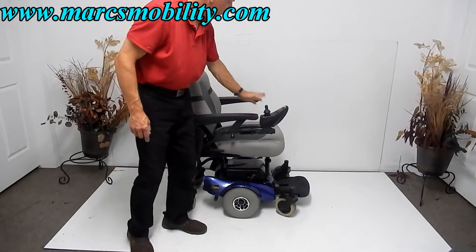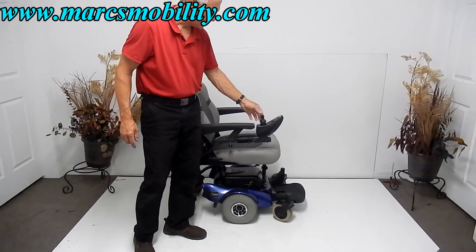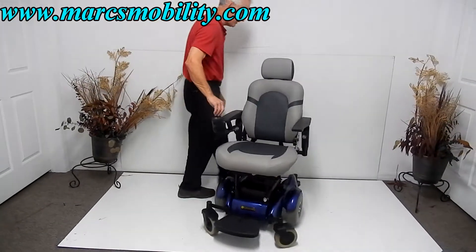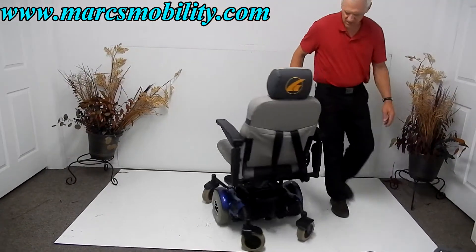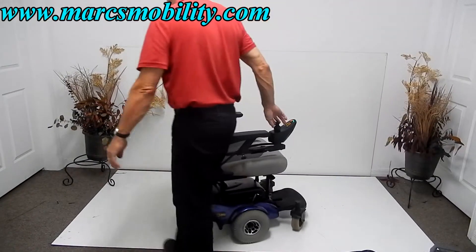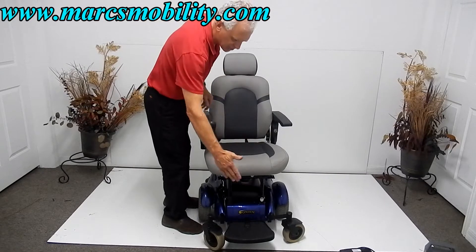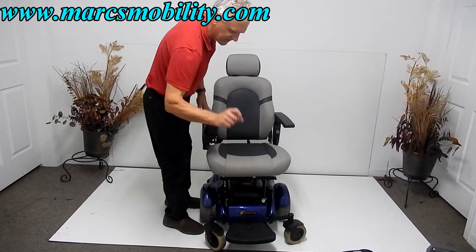Solid tires in the middle. You've got a swing-away joystick, and the joystick can be positioned on the right or the left — no problem doing that. You can see how sharp this chair turns; it'll turn pretty much inside of itself.